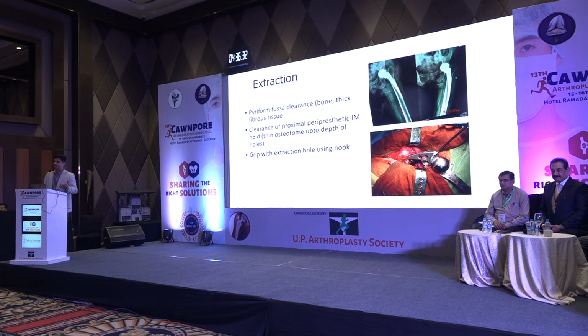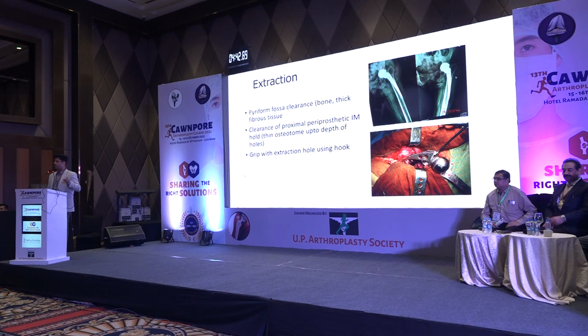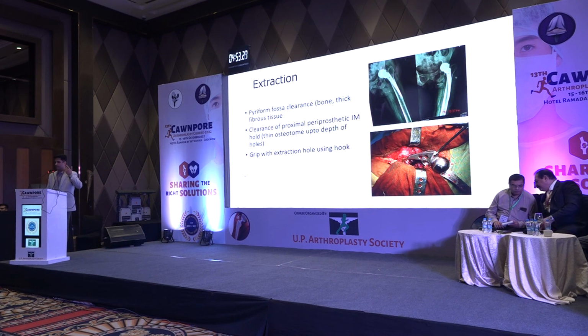For cemented prosthesis, it's relatively easy because you just have to clear the soft tissue and the granulation tissue around the upper end of the prosthesis, and you can just punch it out or hammer it out because the cemented prostheses are usually smooth and they're actually not fixed into the cement, but they're just sunk into the cement. So you can just pull it out or just back tap and hammer it out. Whereas uncemented ones can be a challenge.